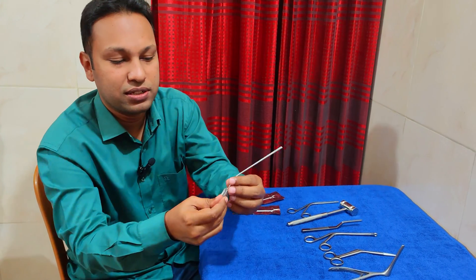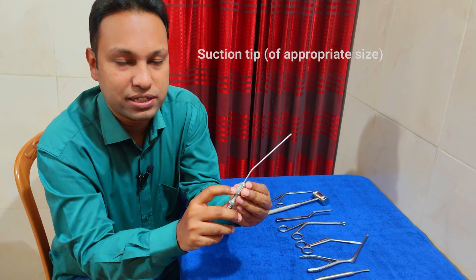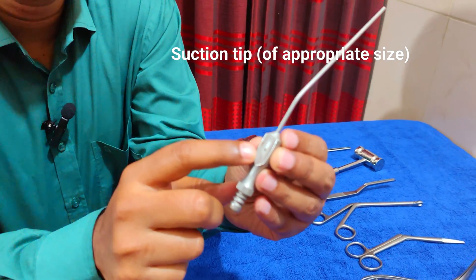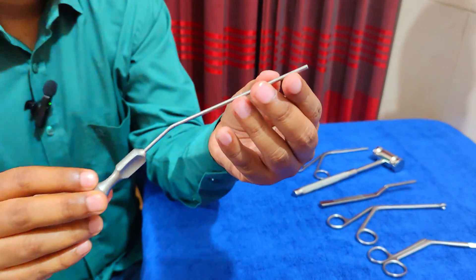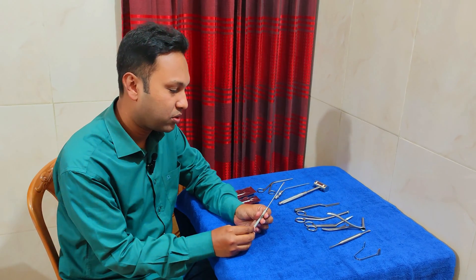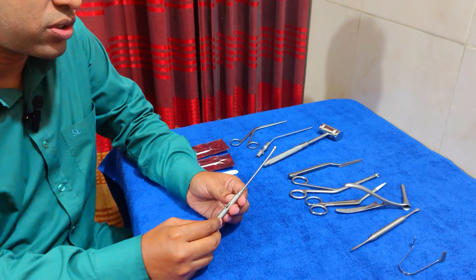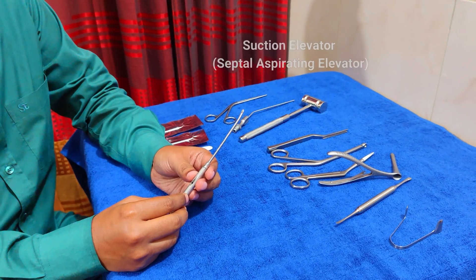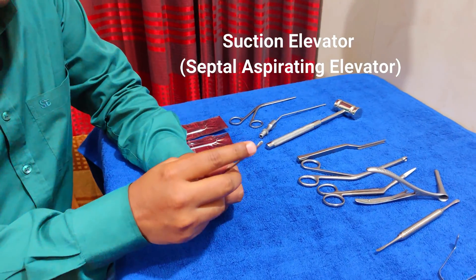This is a size 8 nasal sucker suction tube, which is useful for septal surgery. And this is known as the suction elevator, also called the septal aspirating elevator.